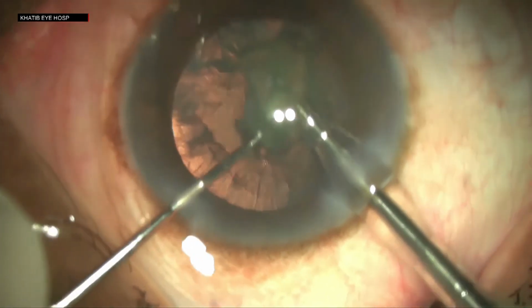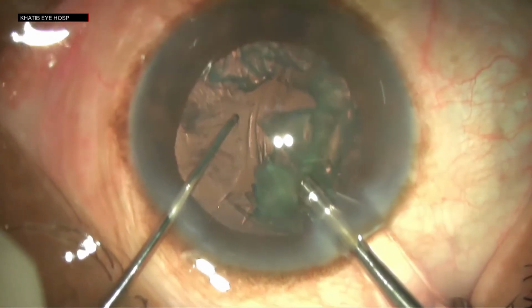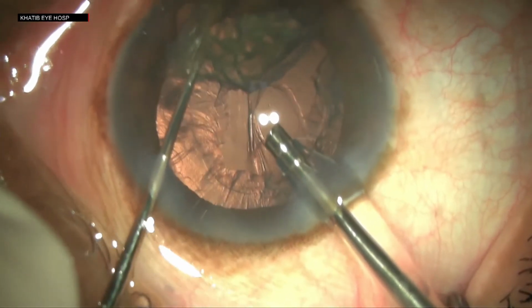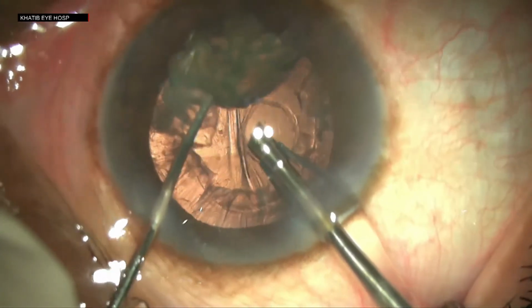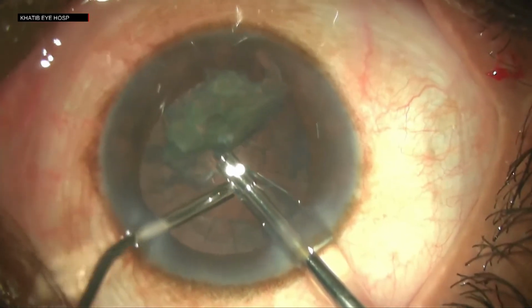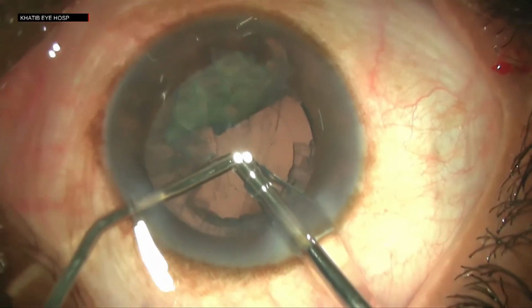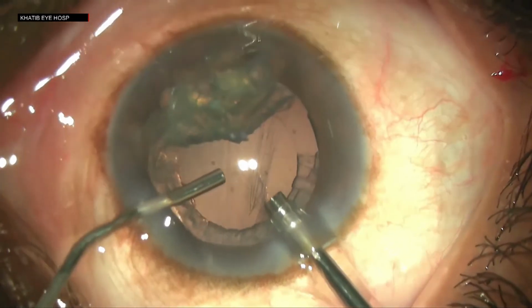Now, as I suspect a PCR, I should have immediately lowered the bottle, but I am still in denial, and as I move the nucleus away to confirm, vitreous is constantly getting hydrated. Now, in fact, I can see the rent staring at me, but I am slow in planning, and you can see how the ruptured margins are constantly fluctuating with infusion. By the time I have decided to put in OVD, the damage has already been done and I am staring at a large PCR. It's going to be extremely risky to put in a trifocal lens in this bag now.